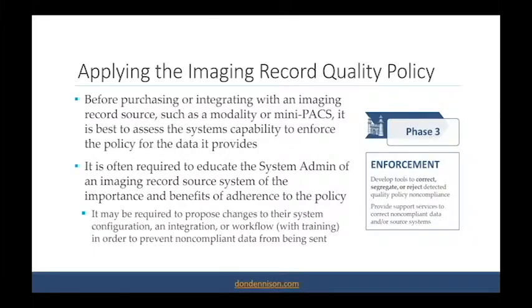We've gone to the effort of defining what we deem a clear and consistent record, and we would like to sit down and talk to you about your system and your acquisition processes and look at your records so that we can ensure we're on the same page. And this can often be viewed as very positive. The system admin gets some understanding of these things, which they may not have had, and they also understand the rationale behind why this is important, and the benefits of it.